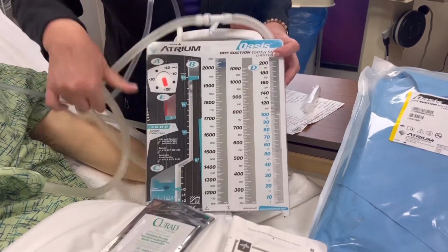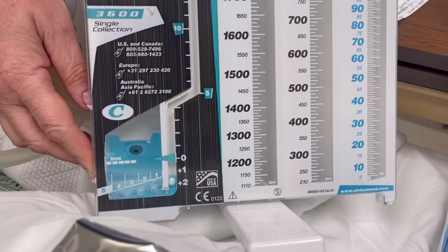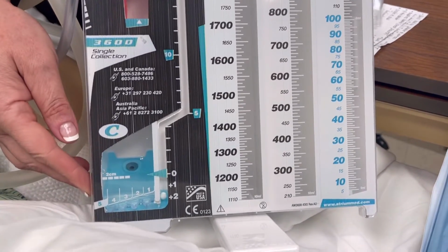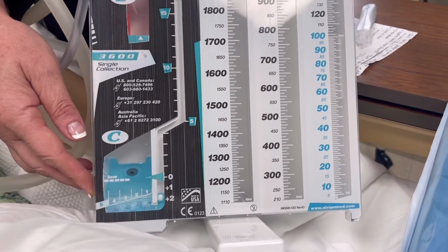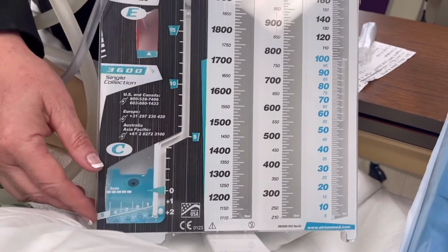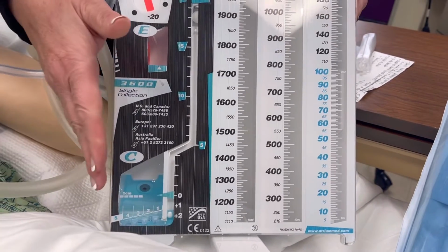I'll talk a little bit about air leak management. We have a little bit of an air leak intermittently. That is okay. It's actually quite common and normal, and we're waiting for that to resolve, and that's a lot of the reason why we've got the chest tube in place to begin with. However, if you see a continuous air leak, which means I'd see a lot of agitation and movement there, that is an indication that I have an ongoing and continuous air leak.